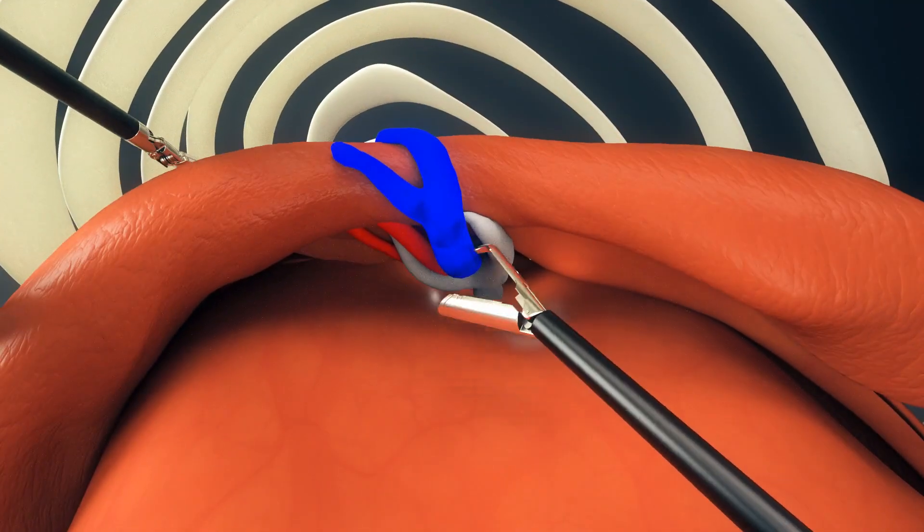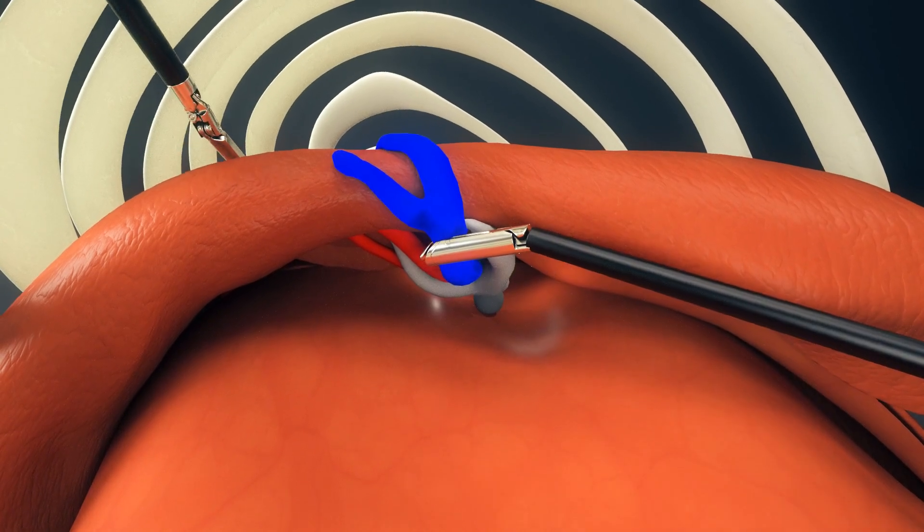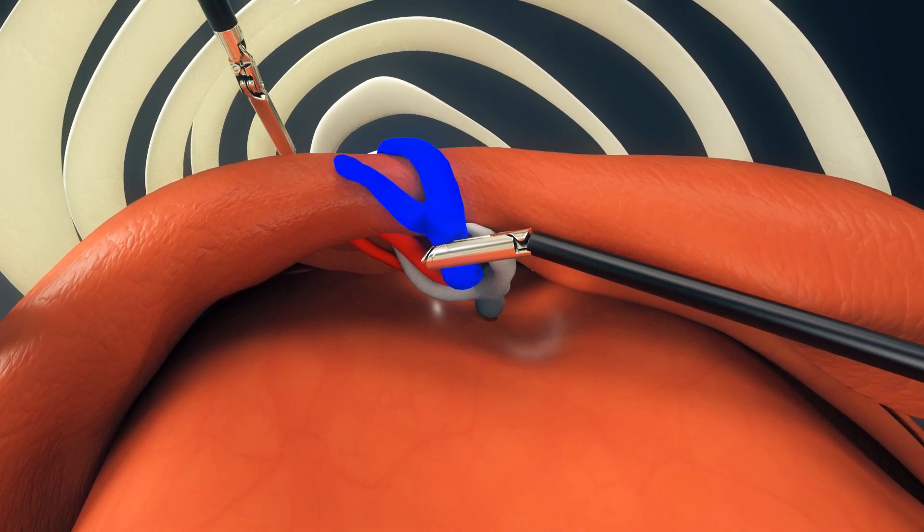These three vital structures must be identified and divided at every lobectomy using a special surgical stapler that the surgeon controls from the robotic console.